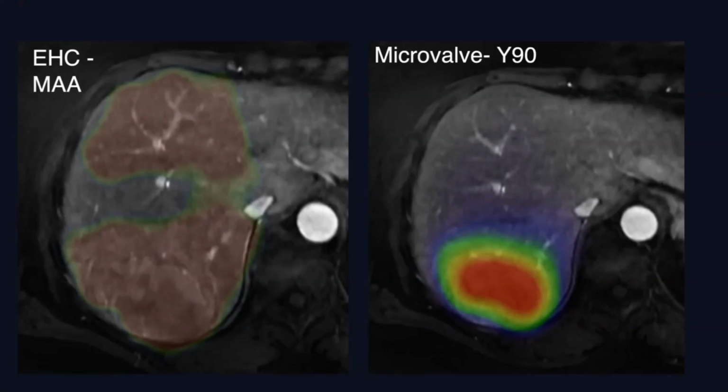And so you can see we used a microvalve. We treated from exactly the same position, just a right lobar infusion at the time of Y-90. And as you can see here, this is our uptake SPECT CT from the Y-90, where you can see really dense uptake inside of the tumor. This looks identical to the paper that I was referencing earlier, Jarek et al. in JVIR from last year, where they took oncopigs and used both end-hole microcatheters and the microvalve catheters, and they saw similar pictures just like this.